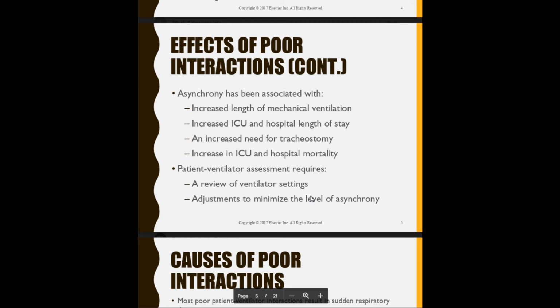So in that situation, you want to switch them to SIMV to allow them to breathe on their own. And depending on how much their volumes are, if they're pulling 450, 480, and you put 500, don't even add pressure support. But if they're pulling 200, 220, and you had them at 500, and you see that their minute ventilation dips when they trigger their own breath, yeah, go ahead and put some pressure support. It won't hurt.